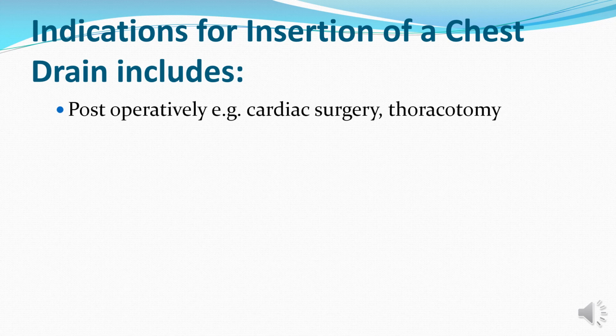post-operatively. We are saying that after certain operations, you need to insert this chest drainage. What operations? Number one, cardiac surgeries. As long as you are tampering with the heart or the area surrounding the heart surgically, after you finish, you need to insert this underwater seal drainage to drain certain substances after the operation, such as blood or any fluid around that area.